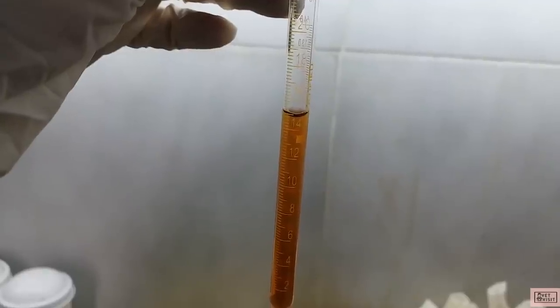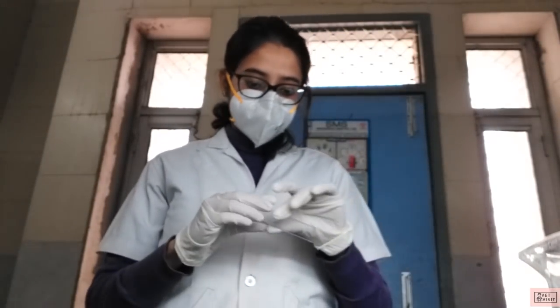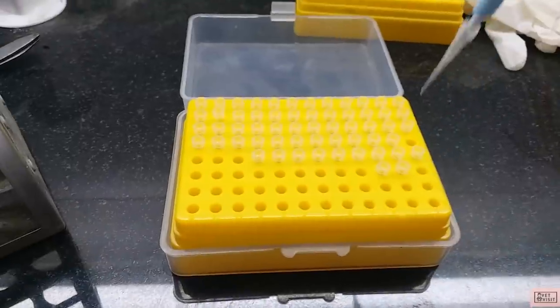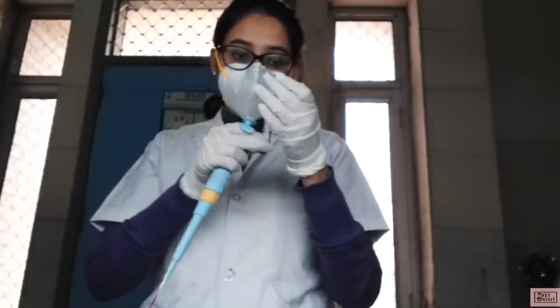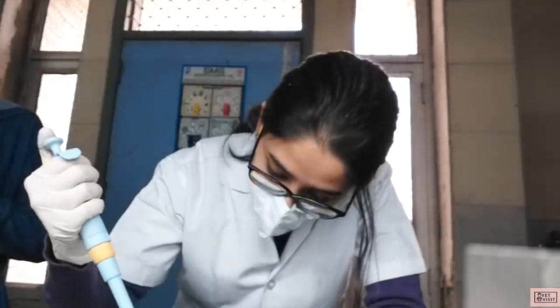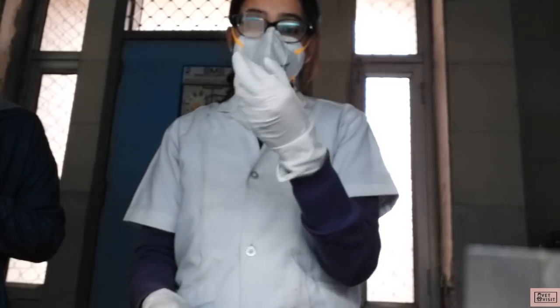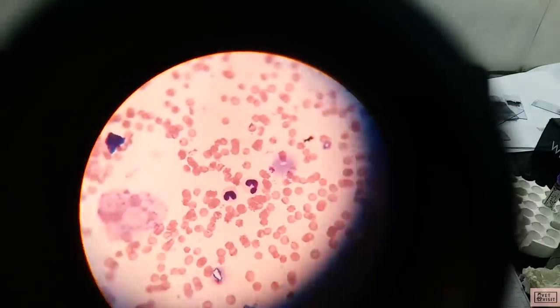Our final hemoglobin value came as 15 grams per deciliter in this canine blood sample. Finally, I prepared a blood smear for the canine blood sample. For that, we need to take a dry glass slide and label it as per the sample number, species, and date. Then we withdraw the required amount of blood sample into the pipette and transfer it over the glass slide. Using an even-edge spreader slide, prepare a thin smear. Let it dry and then start the staining procedure. Once the slide is washed and dried, it is viewed under the oil immersion lens of the microscope.